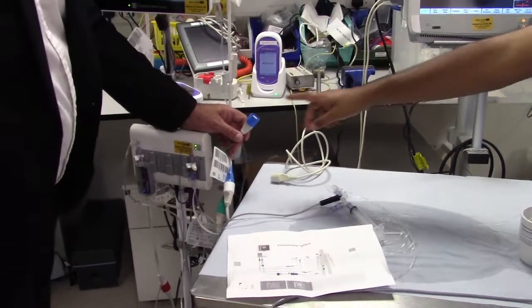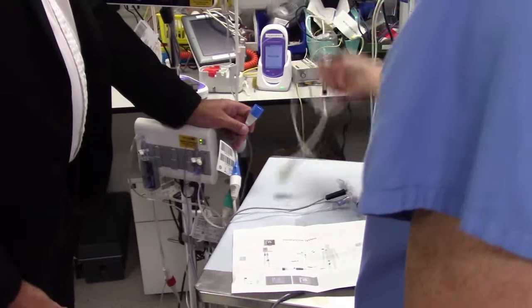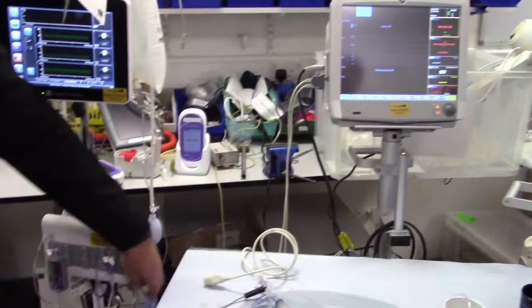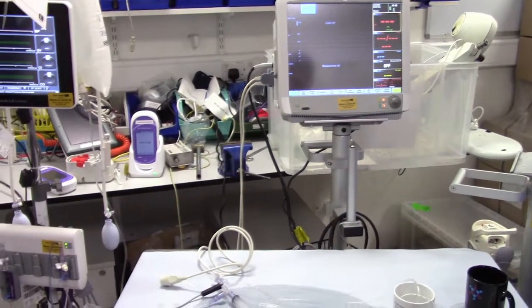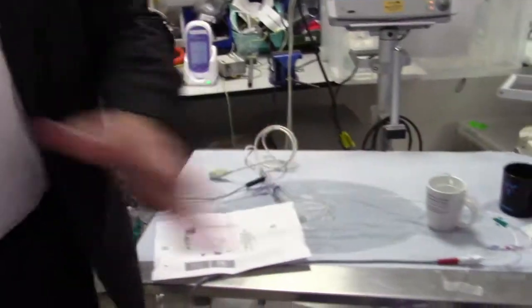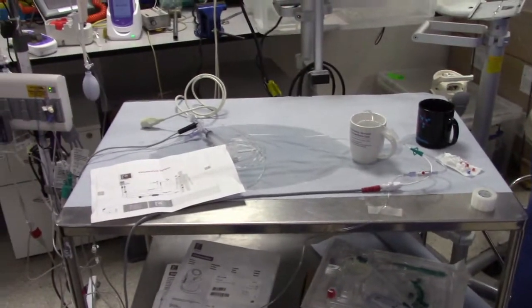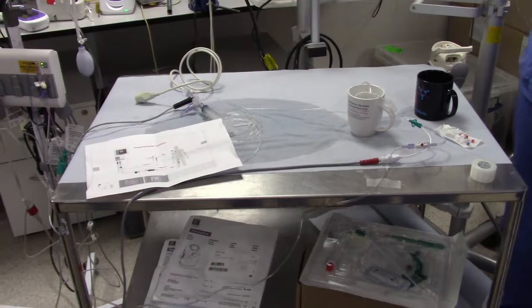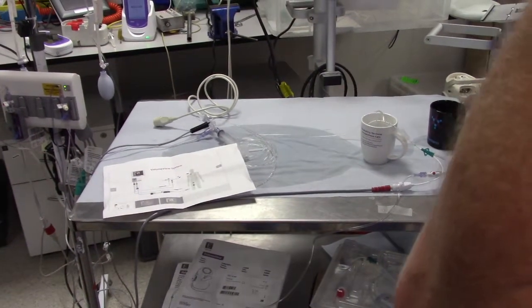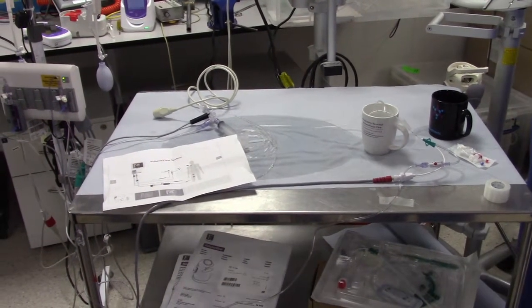Sorry, just want to make sure, where would this connect here? Same way as you would do a normal transducer. Exactly the same way. They're going P1, P2. It doesn't change. It means that catheter will give us arterial pressure as well. Yes, so you're just measuring. This catheter will be the same as you using an arterial cannula on a radial. It means we don't need another arterial catheter. You wouldn't need a radial line, no. Yeah, P1. And we can't take blood for tests from there? Well, there's no reason you can't.